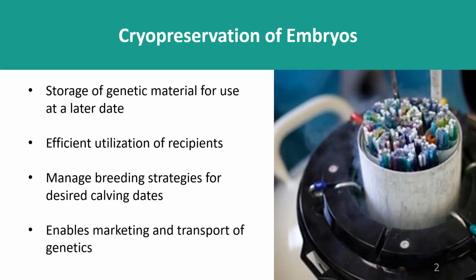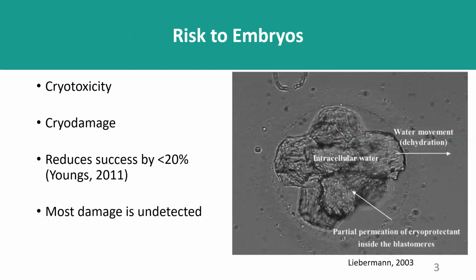Cryopreservation of embryos allows for storage of genetic material for use at a later date. It makes more efficient utilization of recipients, helps us to manage breeding strategies for desired calving dates, and facilitates marketing and transport of genetics. However, toxicity of the cryoprotective agents and cryo damage due to intracellular ice formation are two factors which can lead to lower pregnancy rates with frozen embryos.